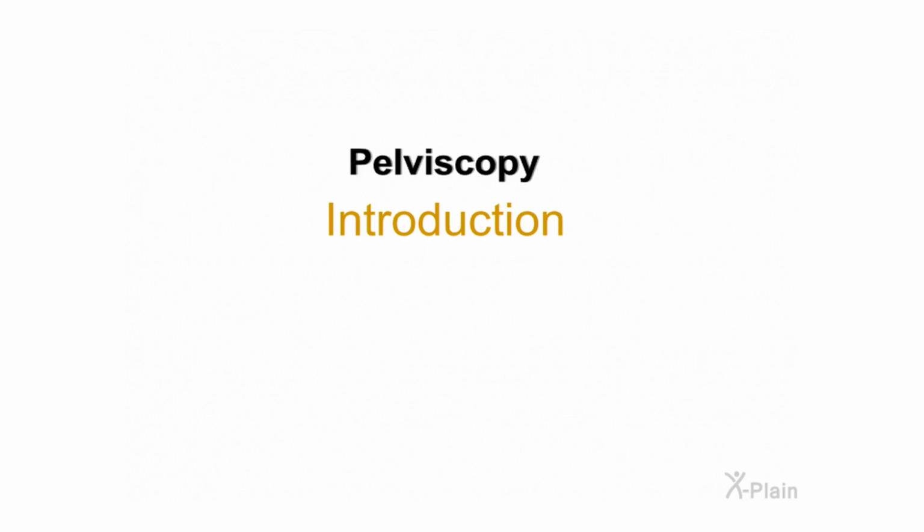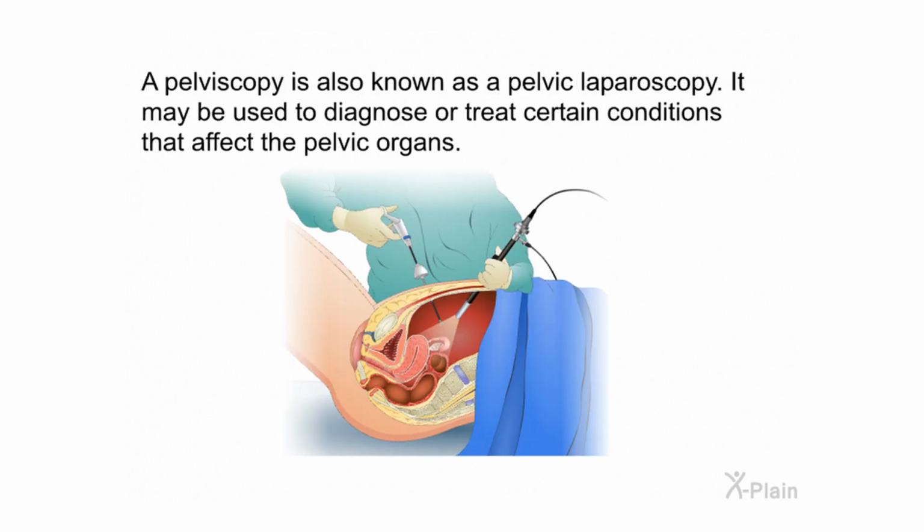Pelviscopy. Introduction. A pelviscopy is also known as a pelvic laparoscopy. It may be used to diagnose or treat certain conditions that affect the pelvic organs.